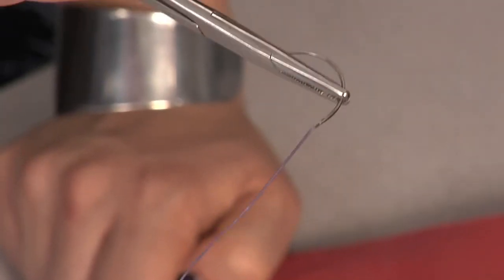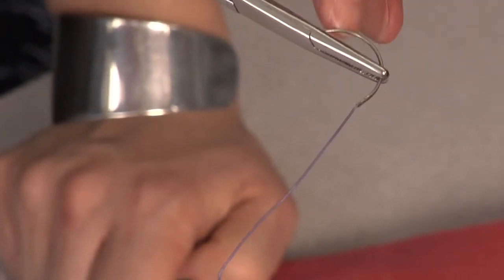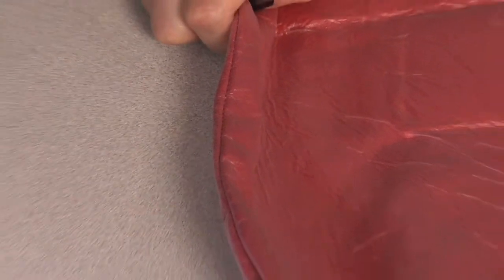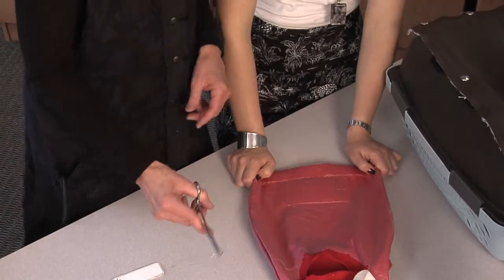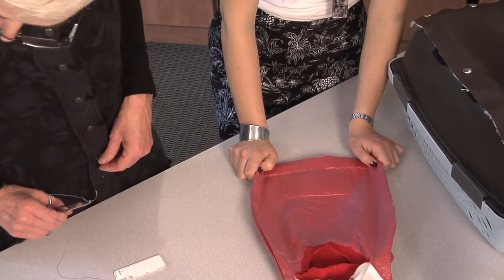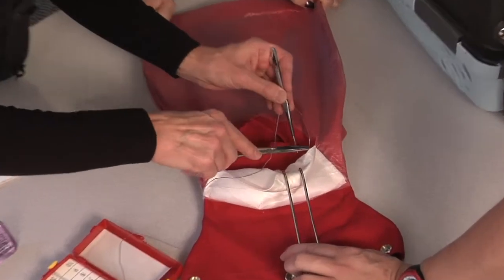When you're not sewing with the needle you need to put it back and protect the point, which is really important for every surgeon — especially if you're working in an area with more blood-borne diseases like HIV, for instance in Africa. Needle protection like that, if it becomes a habit, could save the nurse's life when passing off, or your assistant's life, or your own. We always try to emphasize that. So then you're ready to use it — there are your forceps.